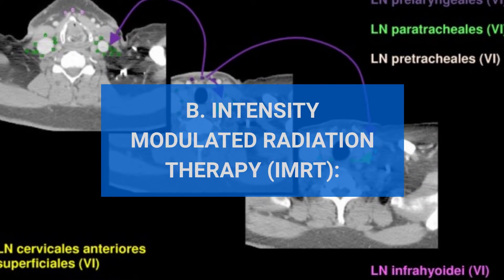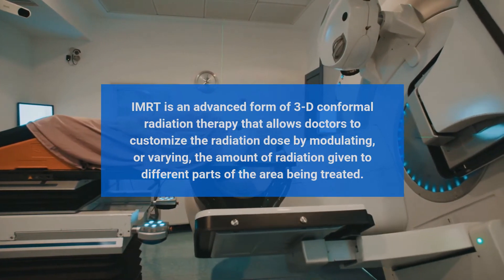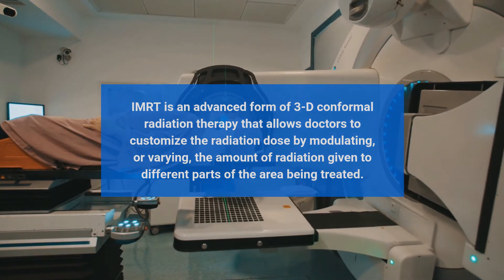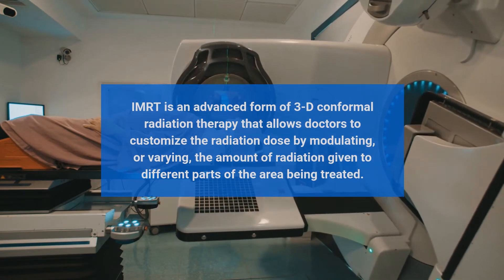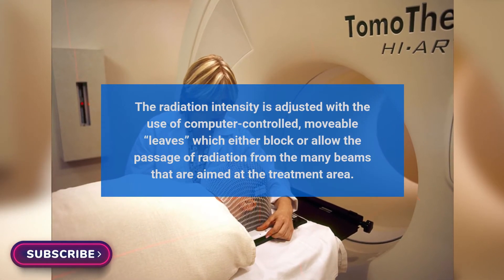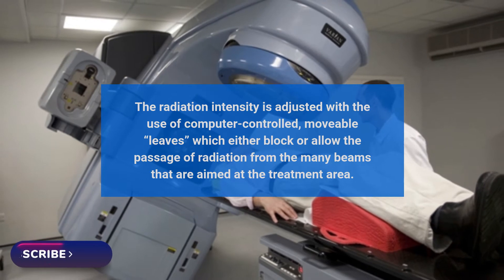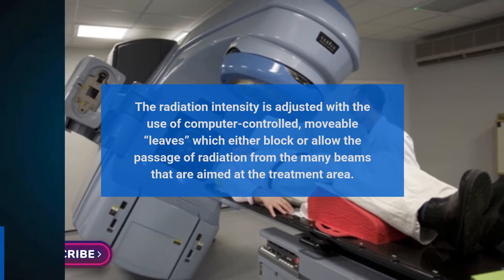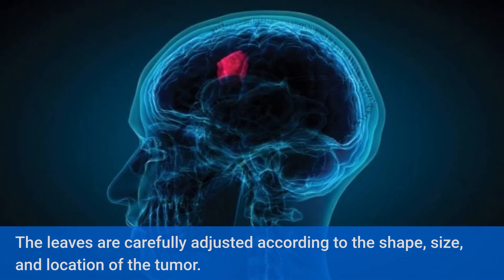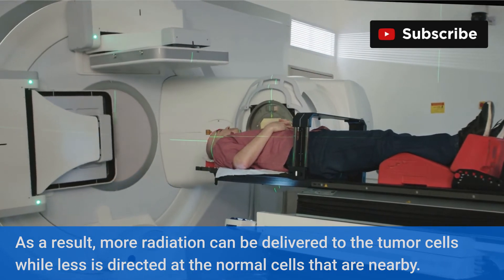Intensity Modulated Radiation Therapy (IMRT): IMRT is an advanced form of 3D conformal radiation therapy that allows doctors to customize the radiation dose by modulating, or varying, the amount of radiation given to different parts of the area being treated. The radiation intensity is adjusted with the use of computer-controlled, movable leaves which either block or allow the passage of radiation from the many beams aimed at the treatment area. The leaves are carefully adjusted according to the shape, size, and location of the tumor. As a result, more radiation can be delivered to the tumor cells while less is directed at the normal cells nearby.